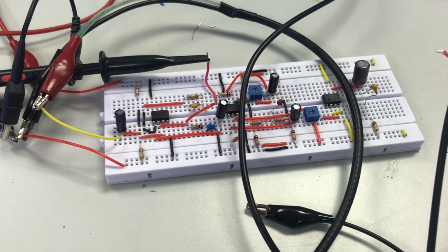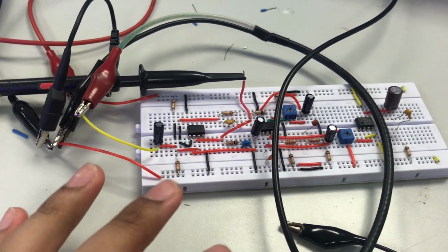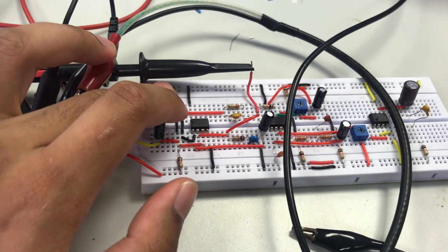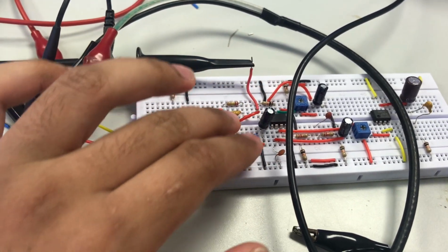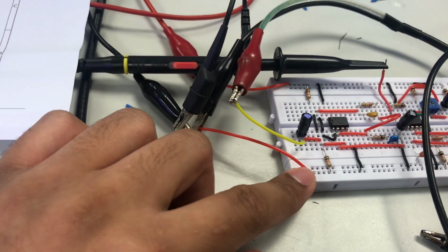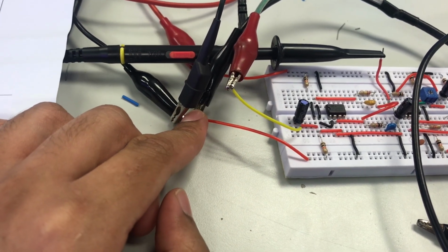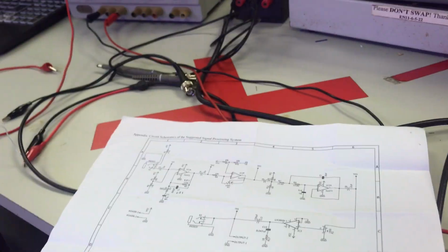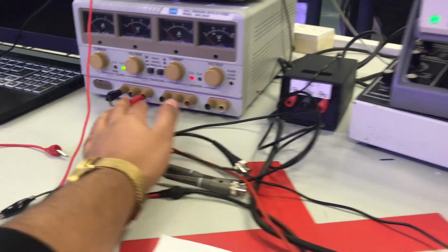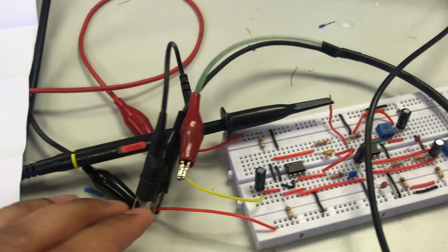Okay, so this is my circuit here. Let me briefly explain what I did on my circuit. This is my ground, this is my VCC. My probe is connected to the point where I'm testing, which is TP2, and my ground here is connected to the ground of the probe, the function generator's ground, and the ground from my power source. This power source is 9 volts. So I've connected it here to my VCC and ground. As you can see, I've connected 3 pins here also.